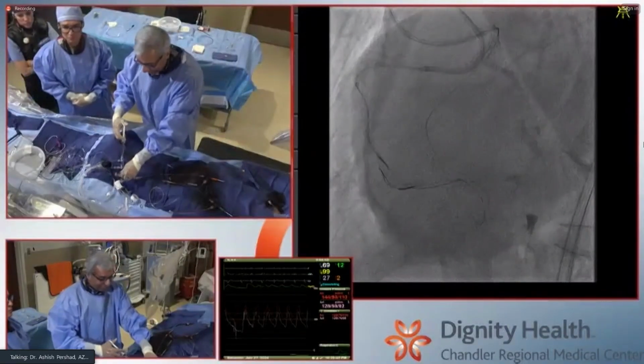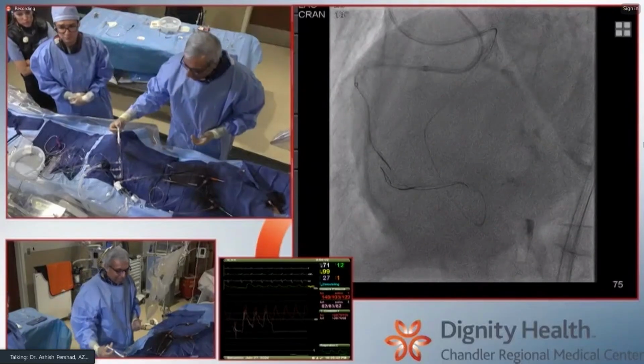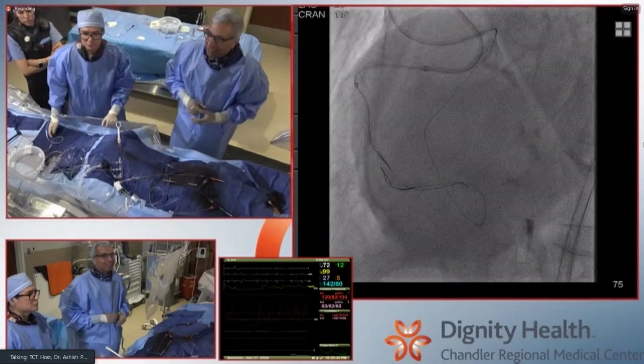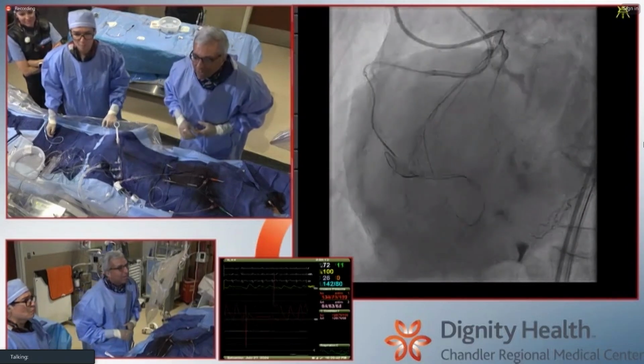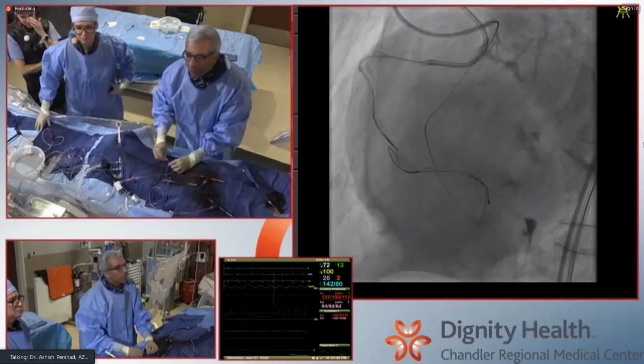It sounds crazy. Did you just go antegrade true? I think so. It feels like it. I'm going to take a retro test and confirm. It feels really weird. It seems intraplaque antegrade. Maybe advance the wire while contrast is filling so you can see. There you go, you're there, man.